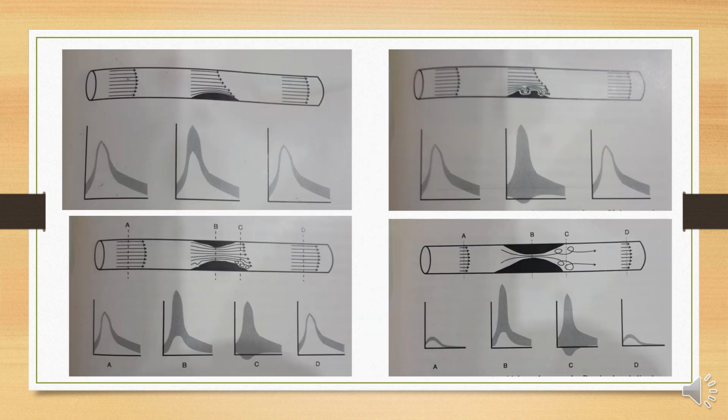The same pattern you can follow in these four images. So this is a road which has some congestion over here. The traffic which is moving on the outer side of the road will have a smooth flow, and on the right side will have a turbulent flow. And if the congestion is from both sides, then the central one will have a good flow, and the peripheral one, this one, because the congestion is more on the right side, will show turbulent flow.